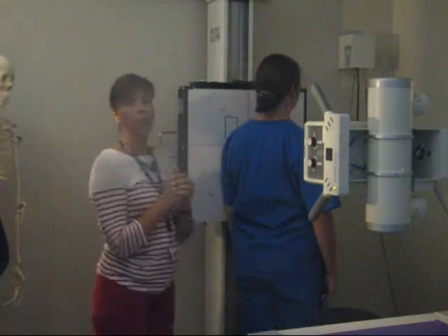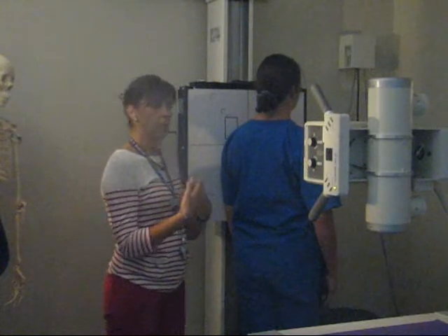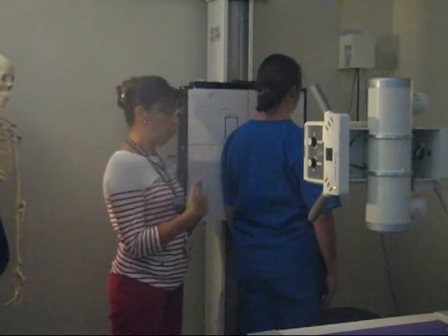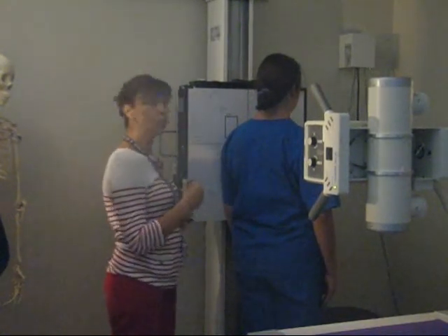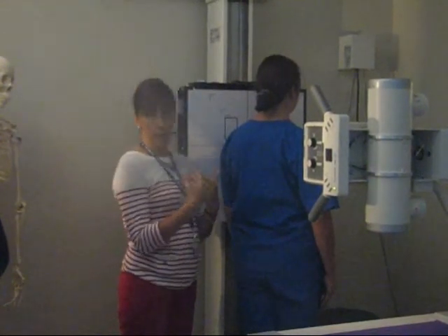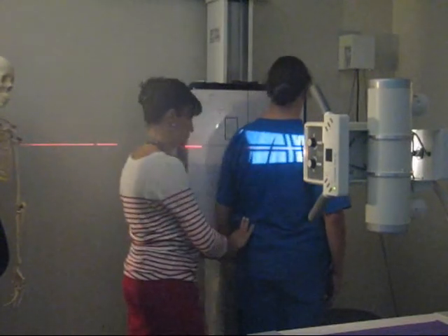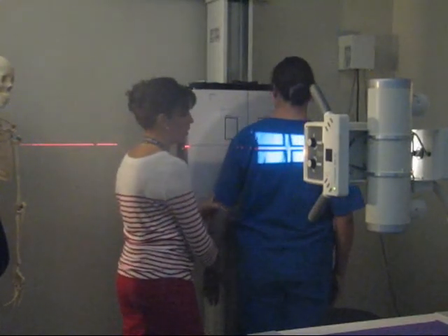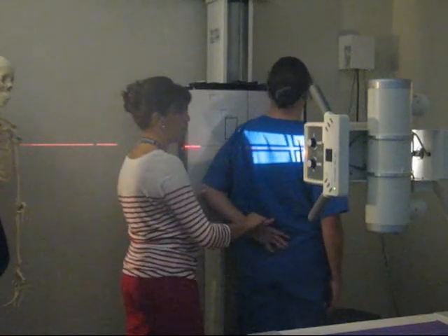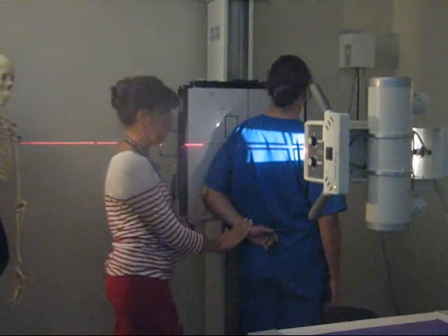Okay? There are two ways, depending on your patient and how difficult it is to position their arm in one way or another, in which you can try to bring the scapula out to see it laterally. One way is to have the patient, if they can, bring their arm behind their back and flex their elbow.